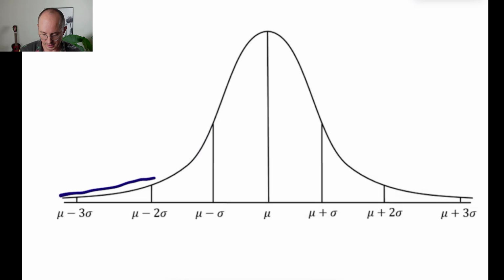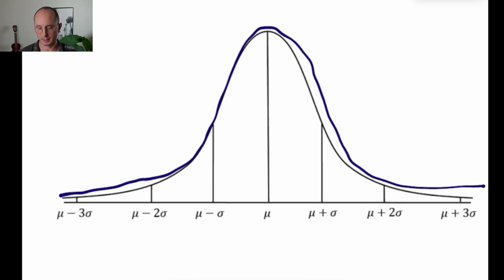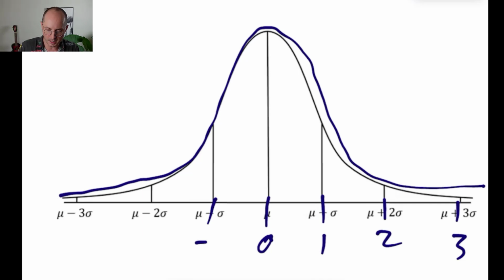If this is that line right here, and underneath it is a distribution of all the men and their T-scores. In the middle here, we have 0, we have 1, we can have positive T-scores, so there's stronger bones there. And then we have -1, -2, and -3.